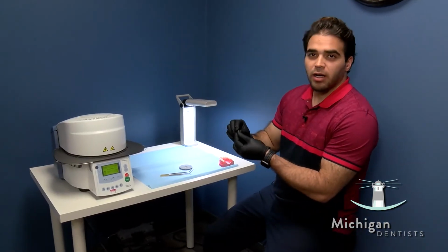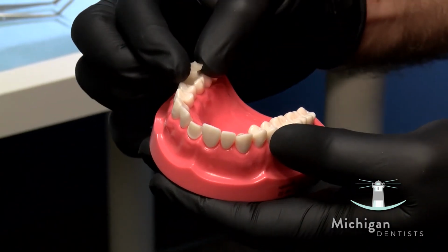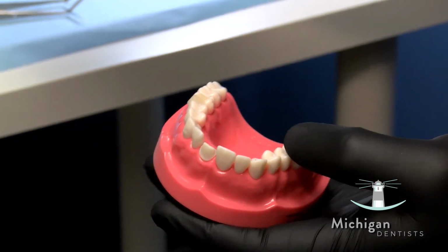So as you can see, our crown is done cooking from the oven. Now we get to put it in the patient's mouth. We cement it, we polish it, and we're good to go.